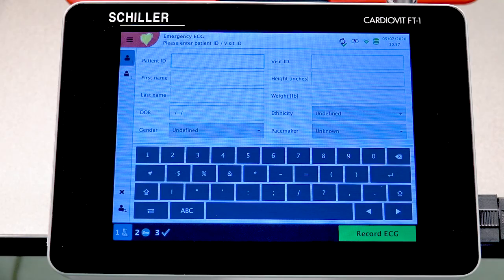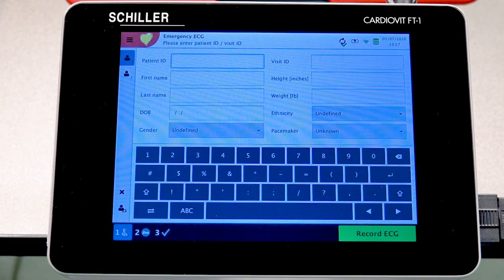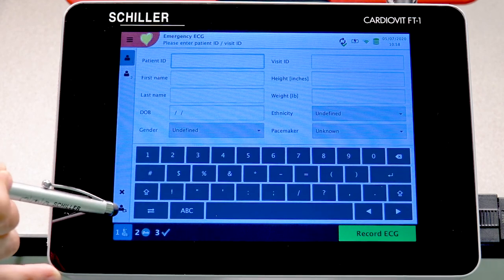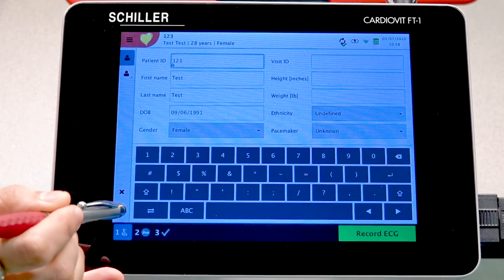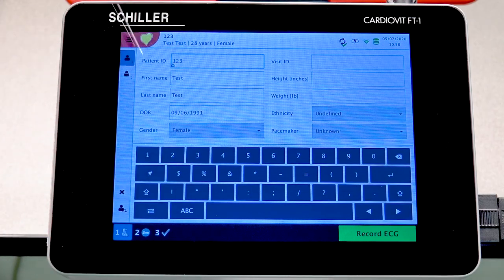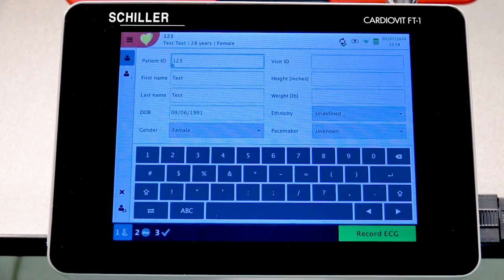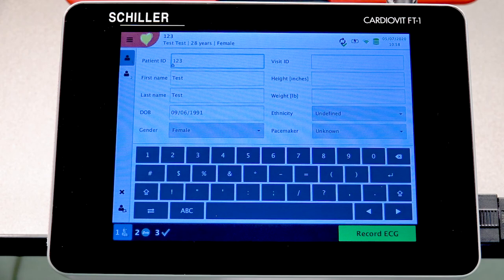Once the ECG report has been transmitted or printed, the unit will take you back to the patient information screen with empty fields, ready for a new patient. If you want to recall the previous patient, use the patient information recall button at the bottom — all fields will populate with the previous patient's information, saving you from re-entering everything.